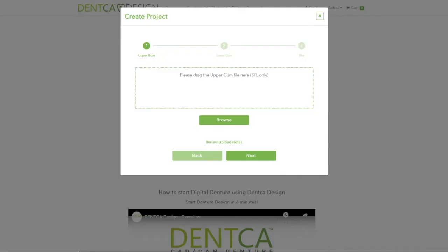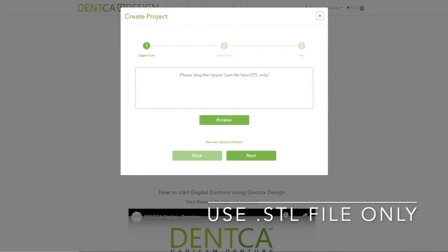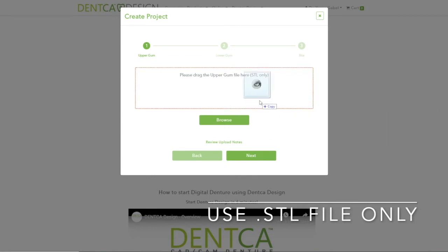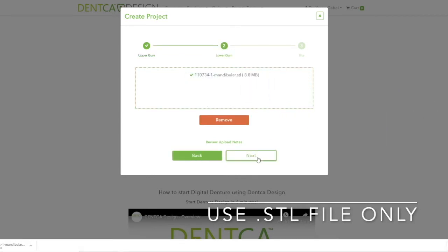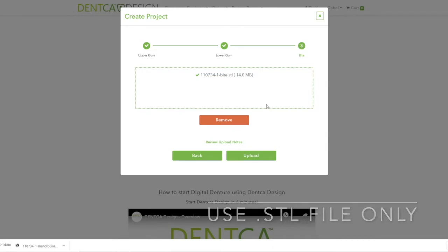To upload your scanned files, drag and drop or add the files with the Browse button one by one. Pay close attention to what type of scanned files it asks for during each step. Please note that certain scanners already align the bite automatically and only release two files, maxillary and mandibular, in their output format.